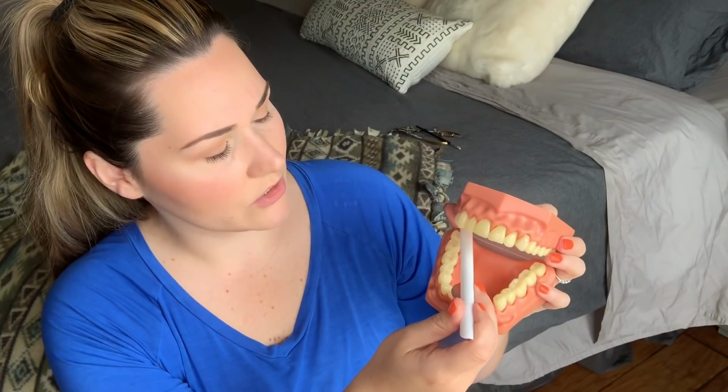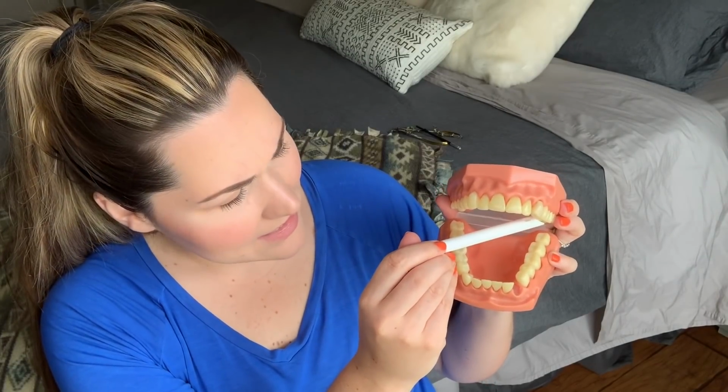Now the reason there's this little curve in here is because if they're working on like this front tooth, you can put that piece up against the tooth like so. Especially with rinsing, when they rinse off the etch and things like that, you want that up against the tooth. Or you can do it behind it if there's something behind the tooth. But you usually want to anchor onto a tooth like so. Sorry, I'm trying to do this backwards because in the camera it's backwards. But like this. And then if he was working on the lower, you would do the same.